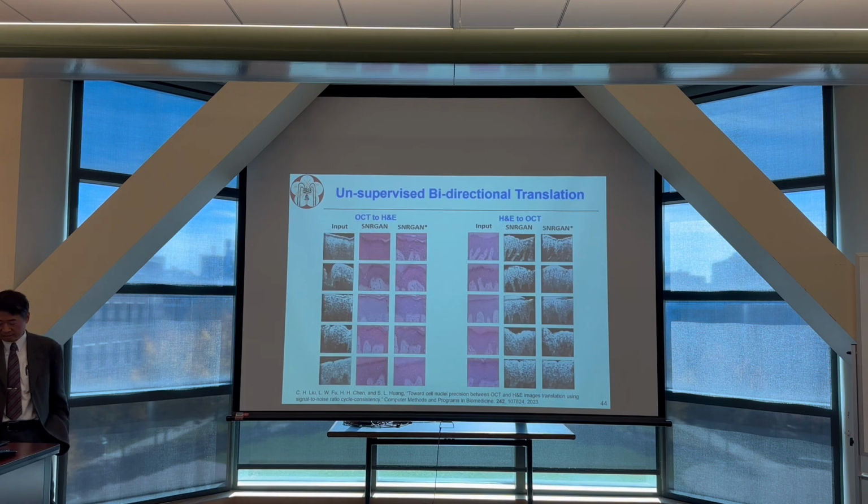And this is the outcome, without any physician's knowledge. We have an input OCT, and this is a translated HE. You can see that the accuracy may not be very high, but at least it looks reasonably good. So this can serve as a kind of pre-training.